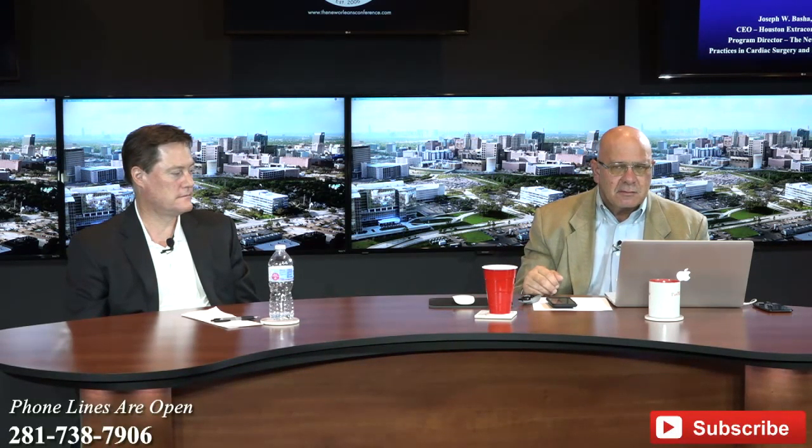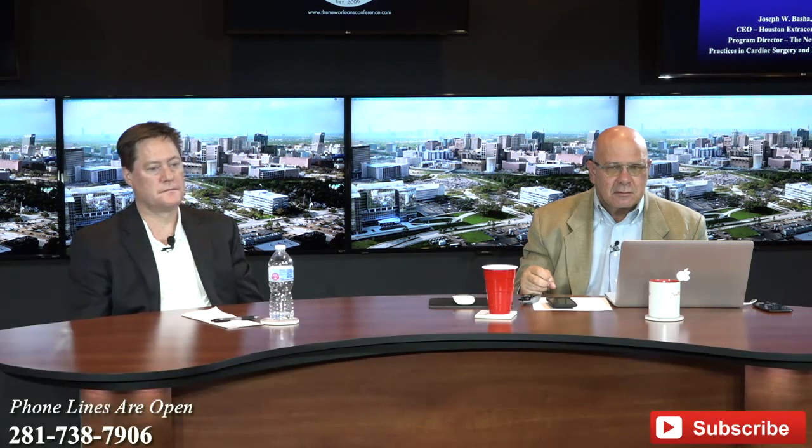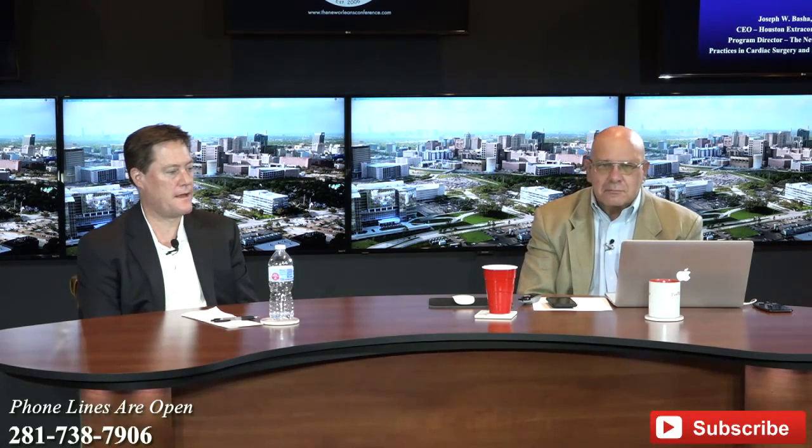At the hospital that I do ECMO shifts at, they pretty much have at least one ECMO patient on at all times. They have a high volume of ECMO patients, and they have a protocol for CRRT machines with ECMO. I don't know if they met with the CardioHelp reps and developed something or what, but when we set up our ECMO circuit before initiating ECMO, we already have stopcocks in place, even if we don't use CRRT every time, for when we do want to add it on. So that's a modification from what the system is actually supposed to look like. It must be. And I haven't seen it without it, so that's all I know.